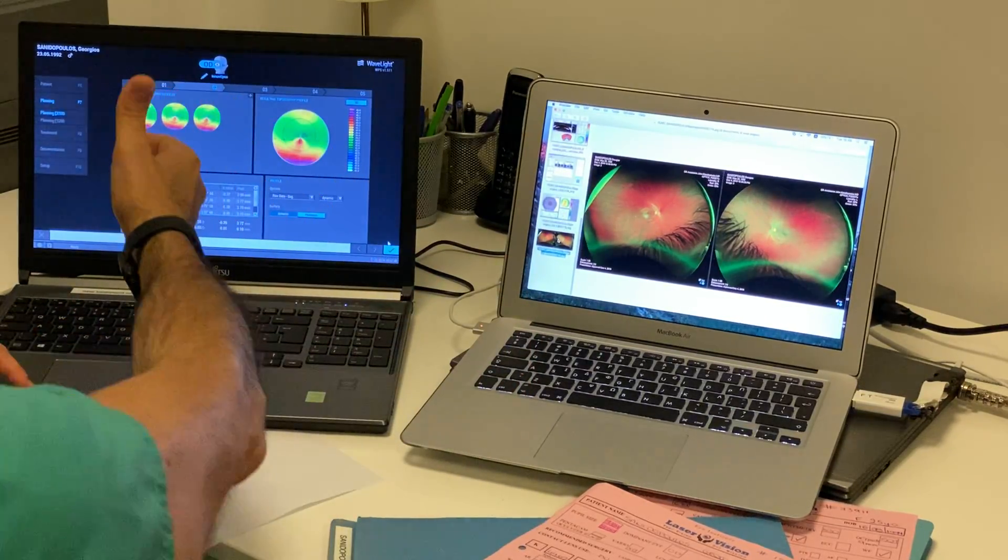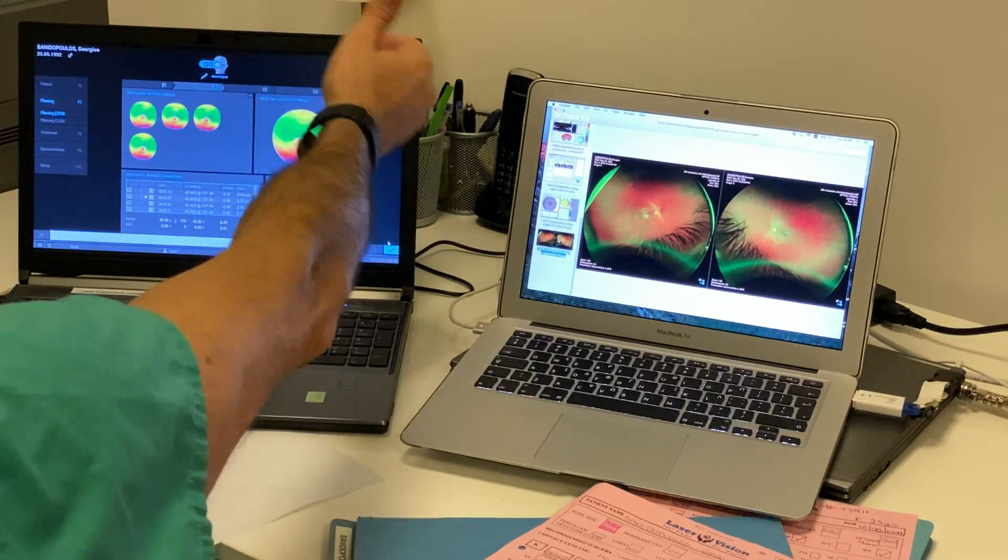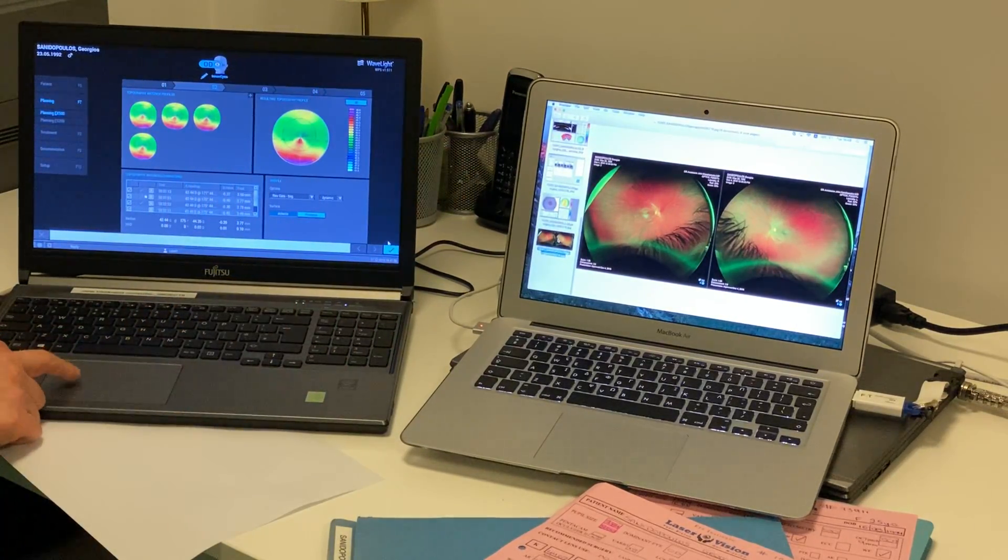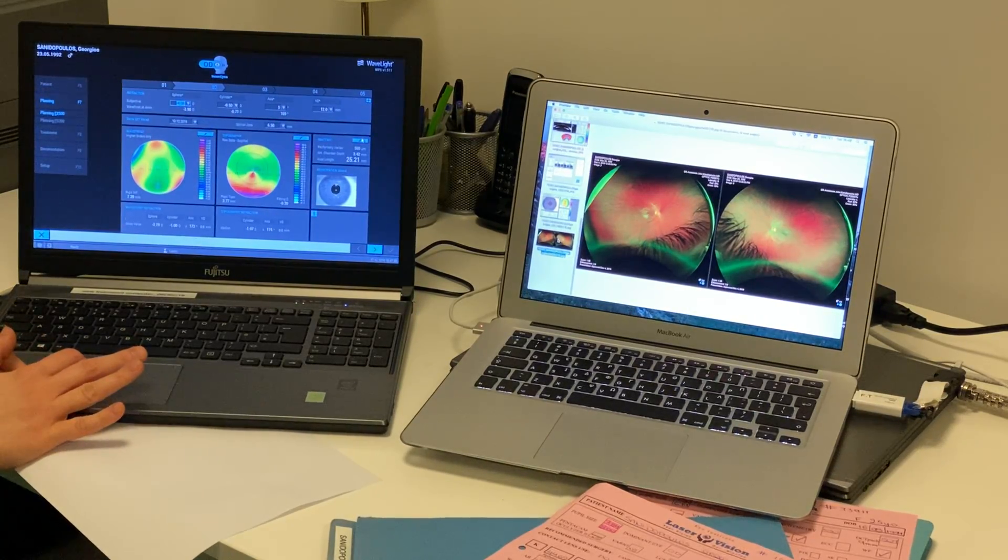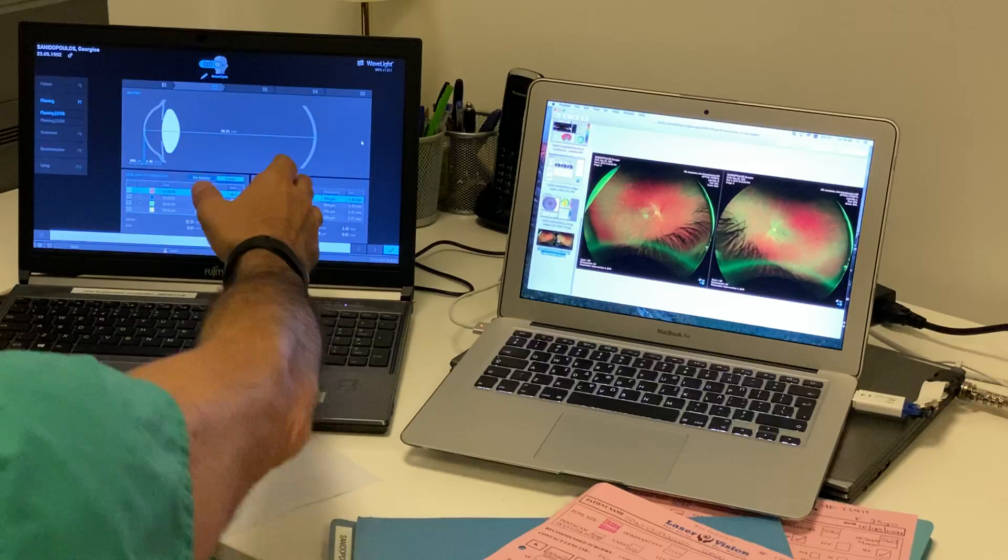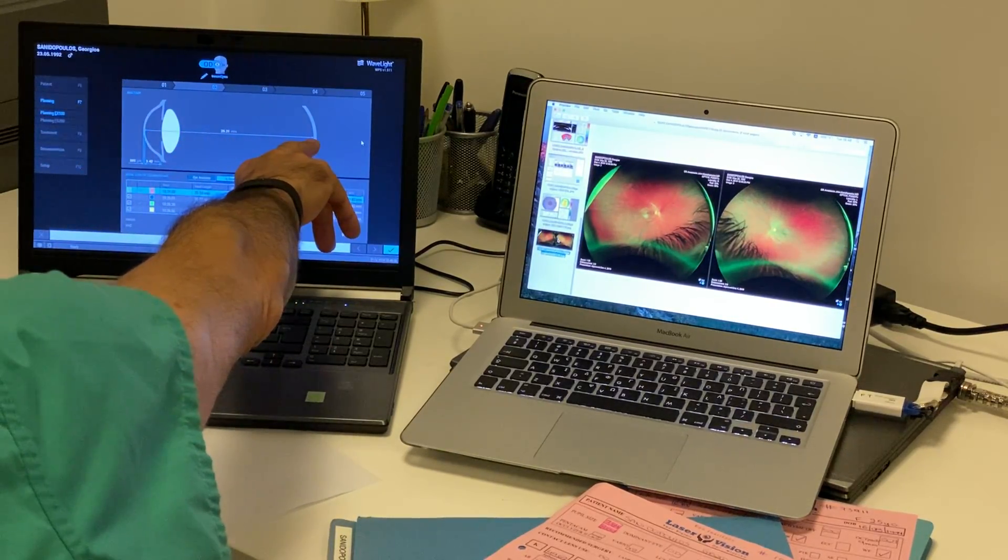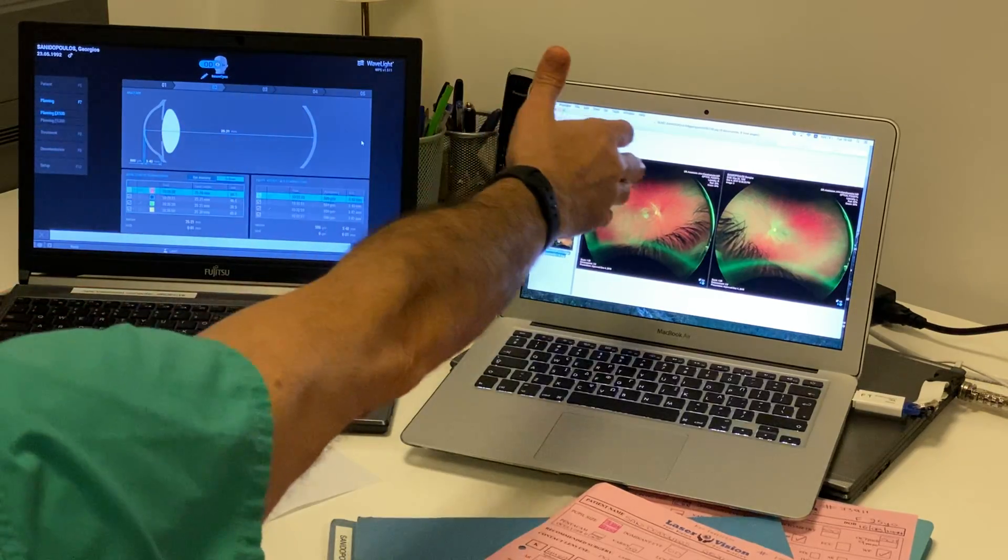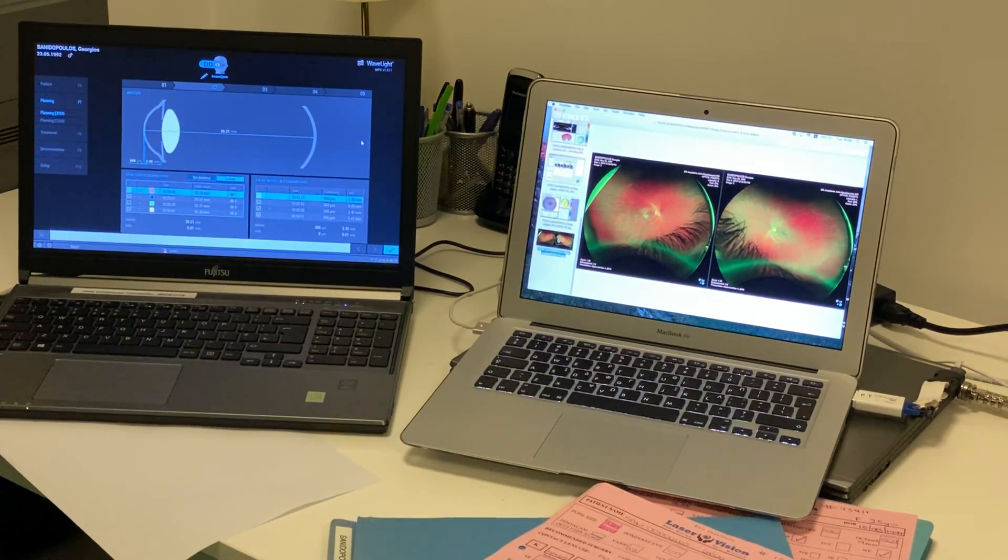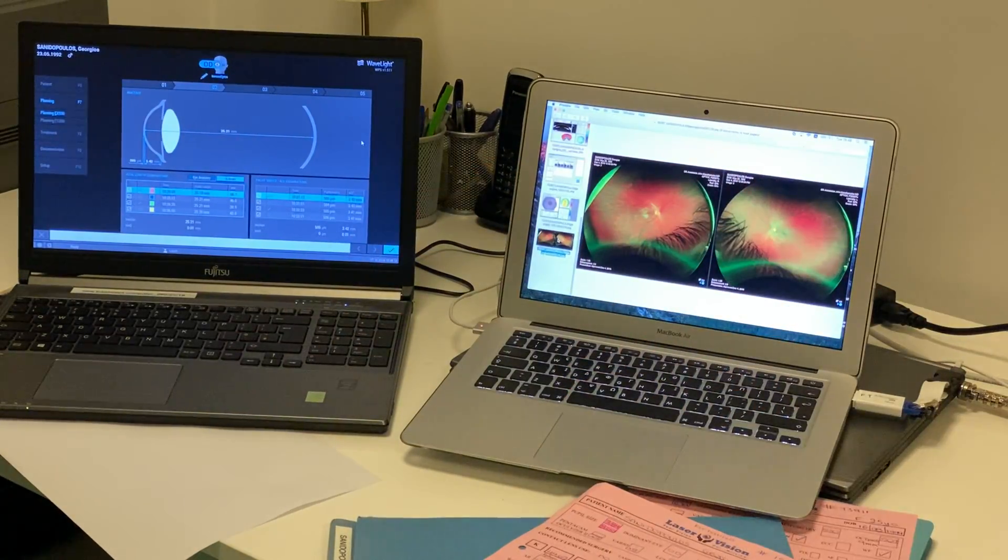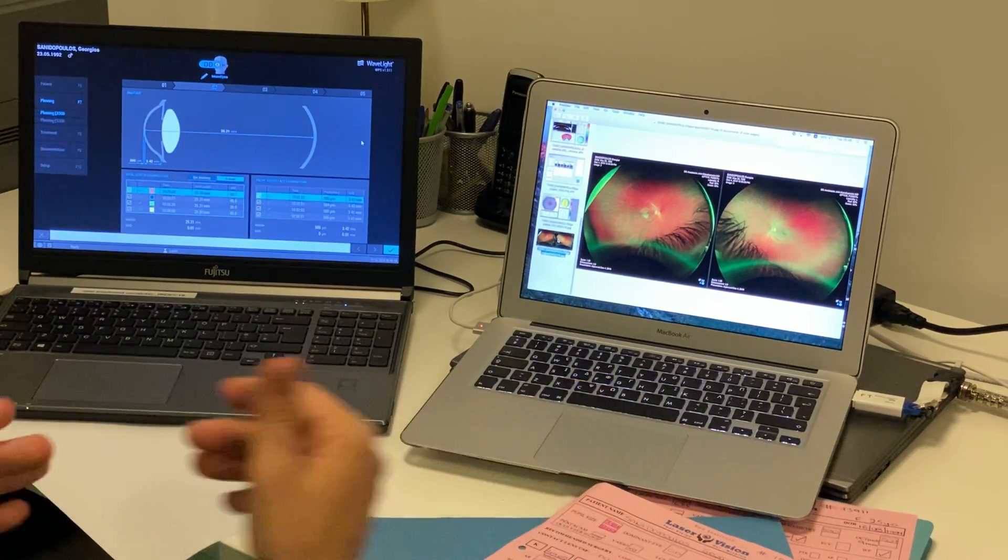So we'll just move on here. If there was some diversity in the measurements, we would do the same thing, exclude the outliers, in order to improve the numbers. And then we'll move ahead. We will visit our axial length measurements, and again, measuring from the tip of the cornea to the macula, 25.21, very close to our device that would measure axial length individually and representing our older technique. And it's also a testament of how accurate these measurements are.